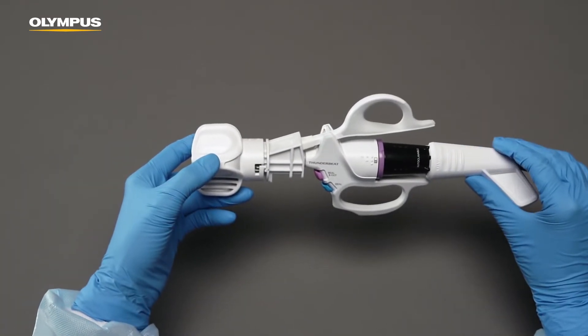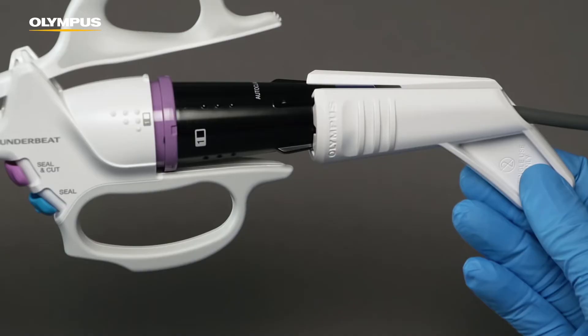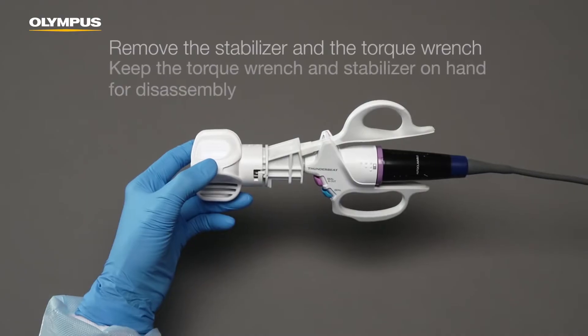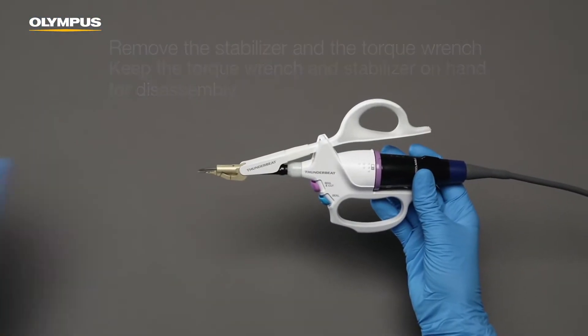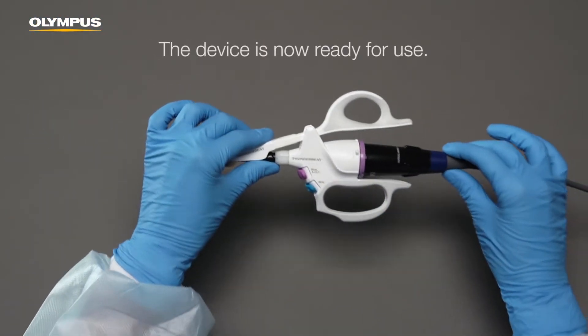Now the transducer and the device are firmly connected. Remove the stabilizer and the torque wrench. The device is now ready for use.